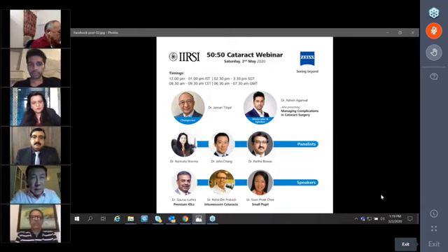Yeah, well, we do a Pentacam on all our patients, and on the Pentacam there is a higher order aberration and spherical aberration. Now, most Pentacam actually advise that if your spherical aberration is more than 0.3, you shouldn't put it in. But we've put in people with 0.5, and as you know, post-LASIK patients, the spherical aberration is much worse, and they seem to do well.